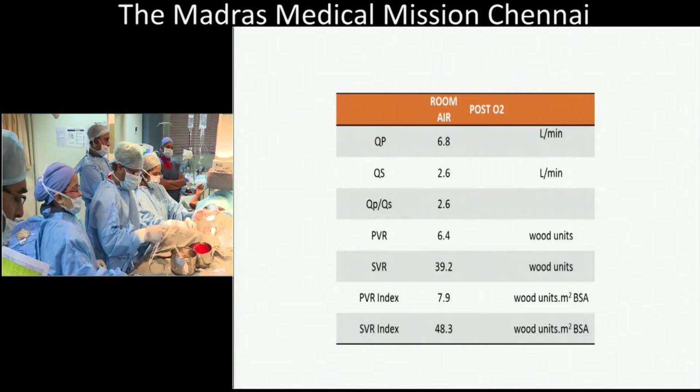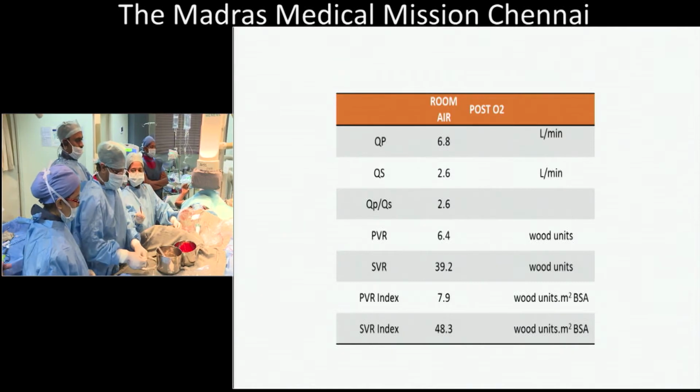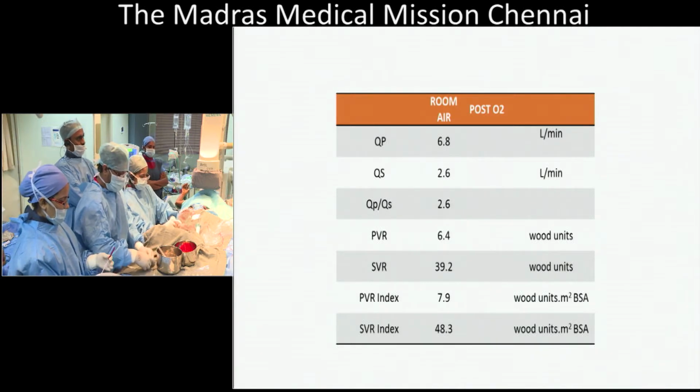Right. Would you then close this straight off with a normal device without balloon occlusion, testing pulmonary artery pressures and so on? I would absolutely go forward and close this defect.